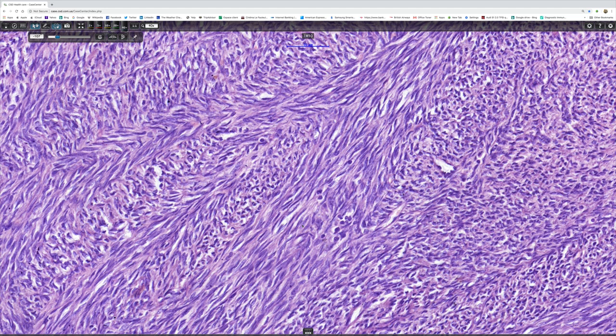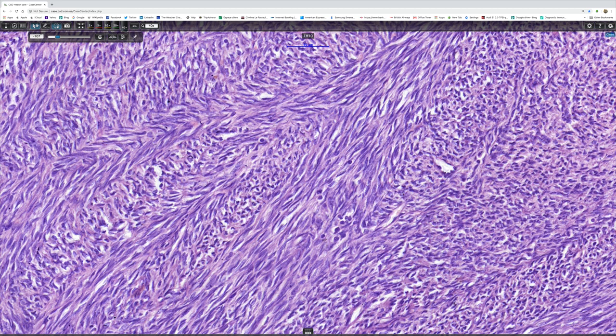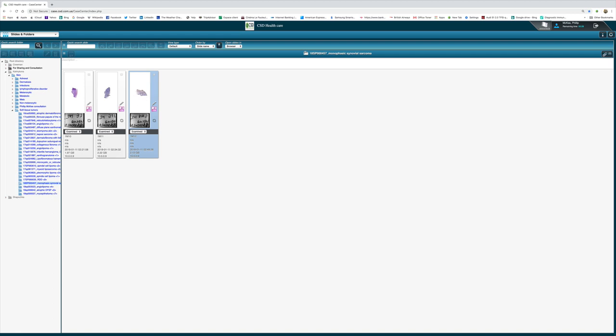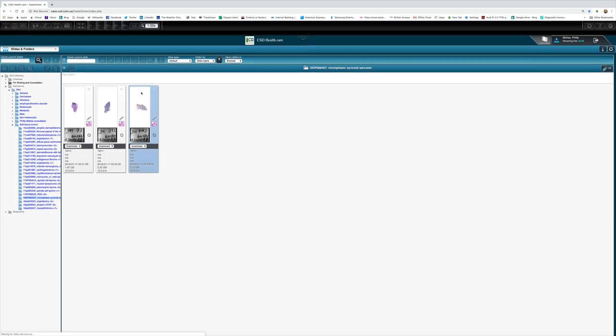Anyway, this is a very nice example of monophasic synovial sarcoma. I couldn't find any glandular differentiation in the tumor. Now Antonina very kindly has done some immunohistochemistry. As you know, synovial sarcomas express keratin and EMA; they also express BCL2 and TLE. I'm going to show you this first immuno, and this is EMA.